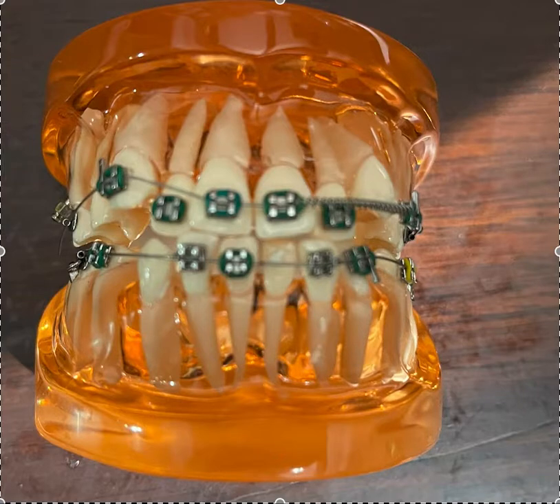If your bracket prescription doesn't match the transfer, then it's a risk, because first of all, you're going to take a look and ask: do I love the bracket positioning? Would I change anything? If the patient was one month from being done and everything looked perfect, and you wouldn't change a single thing, then you're probably okay to keep it. But if the patient's only halfway through treatment, it's probably better, unless that doctor sent a set of brackets as a backup, if you pull all those brackets off and put your brackets on. Otherwise you're going to be in trouble if the patient breaks and loses a bracket, or later down the road if you decide to reposition a bracket. I don't know if that makes sense. Patients don't love that, but that's how it is.